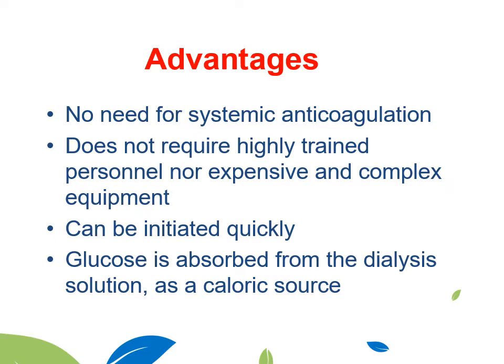What advantages does it offer? It offers that we will not need any systemic anticoagulation. It doesn't require highly trained or experienced personnel, nor complex equipment. It's a really easy procedure. It can be done in 10 to 20 minutes as a bedside procedure in acute cases, so it's easily used and quickly initiated.